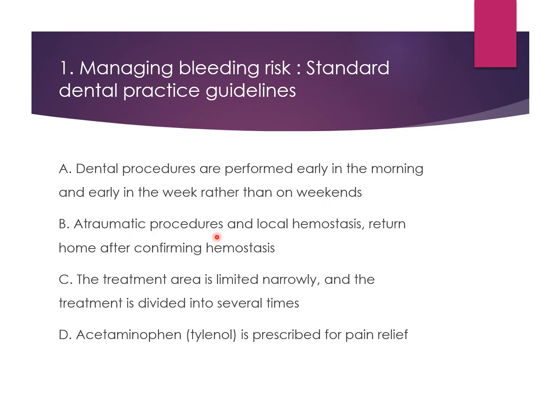Use atraumatic procedures and local hemostasis, and return home after confirming hemostasis. The treatment area is limited narrowly and the treatment is divided into several sessions. Acetaminophen, Tylenol, is prescribed for pain relief rather than NSAIDs.